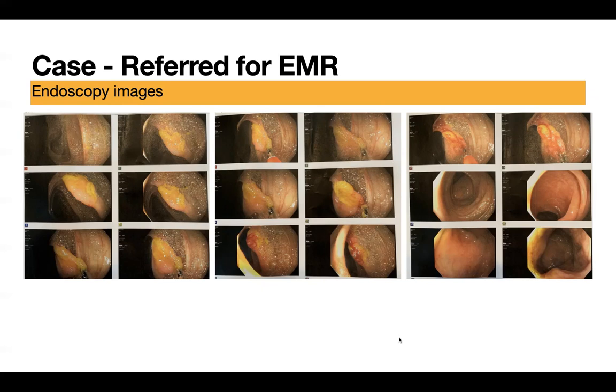If you say the prep was adequate for polyp detection, your pictures should show a prep that is adequate for polyp detection, because from a medical legal standpoint, the lawyer could say, look at all these bubbles. How many polyps could you have missed under there? Did you wash it? If you washed it, there are no pictures of it, that type of thing.